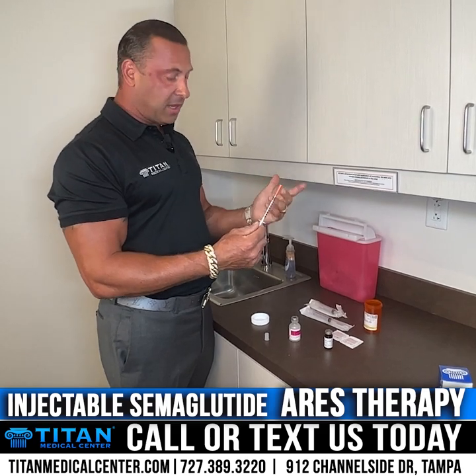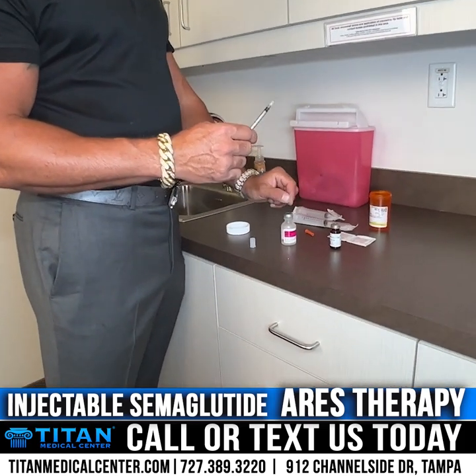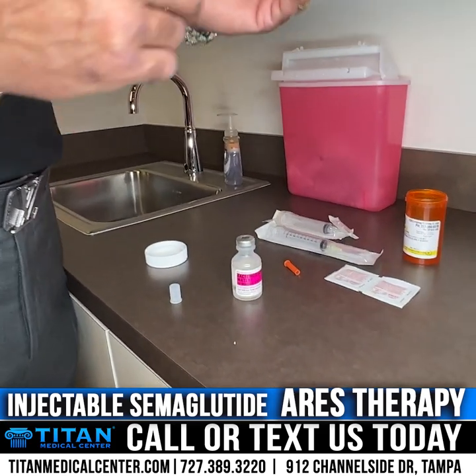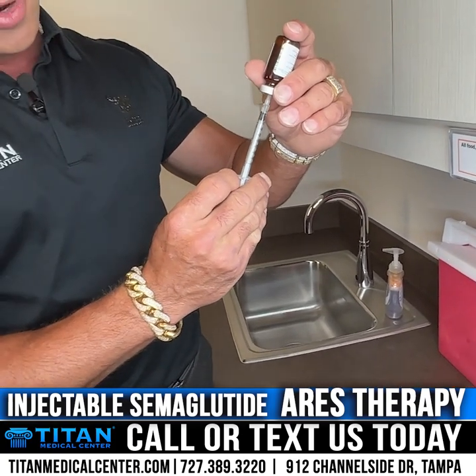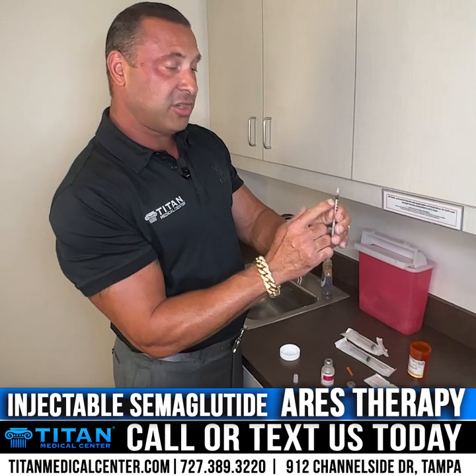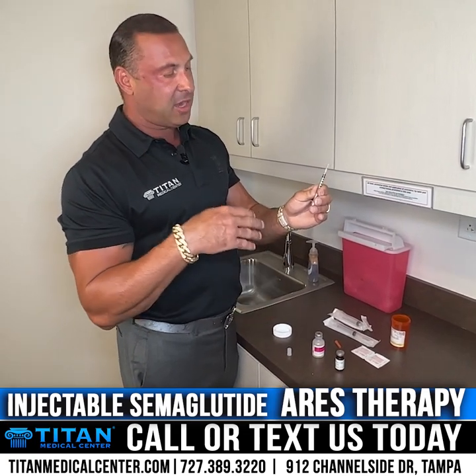Once you've disinfected the tops of both bottles — your semaglutide vial and your bacteriostatic water — you can pull from the medication and inject right in the center of the stopper. I did this before the video, so if anyone has questions about the process, please reach out. Ten units is how much you're going to inject for your first dose of semaglutide. It's really important to pay attention to the directions on your amber vial and your prescription.